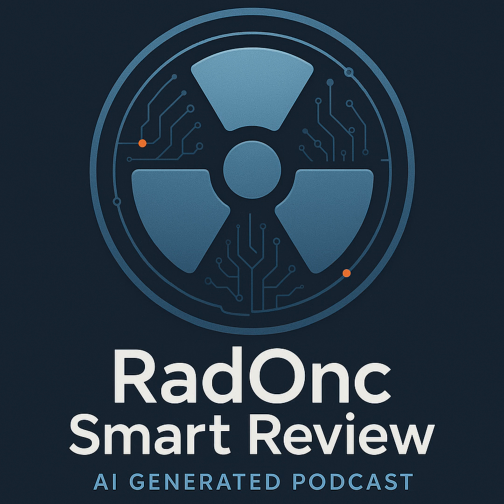Okay, so we've covered a ton of hardware and physics. Why does drilling down into this level of detail really matter clinically? It's foundational. Understanding it helps you grasp beam properties, why LINAC penumbra is sharper than cobalt, how energy affects depth dose, things like that. And huge for troubleshooting and QA, right? Yeah. If something's weird with the beam. Exactly. If flatness is off, you immediately think, is it the flattening filter, the monitor chamber? Is the bending magnet aiming wrong? Maybe the gun? Knowing the sequence gives you a logical path to diagnose problems. Understanding horns explains why profiles look the way they do, especially shallow. And knowing MLC limits, like leakage, directly impacts how well you can plan and deliver something complex, like IMRT.